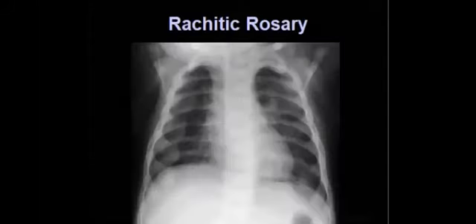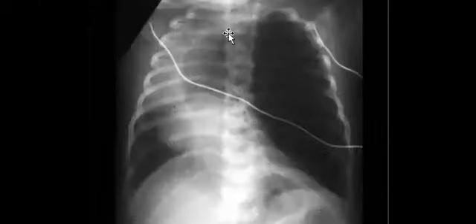So they think that it is like bronchial obstruction, something closing the bronchus, with some air trapping. The most common location is the left upper lobe. And you can memorize that the left lower lobe is for sequestration, the left upper lobe for congenital lobar emphysema. Okay?